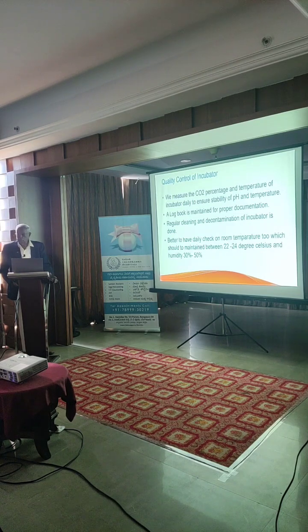You have to have a logbook for every instrument that you're using, and keep a check on all the temperature control, particularly in the room.